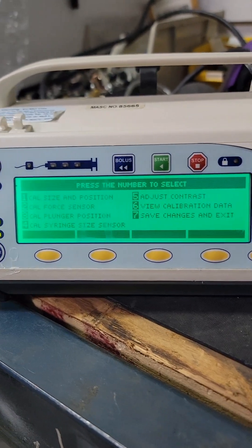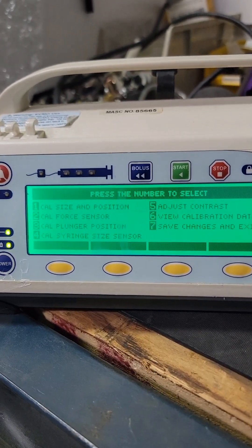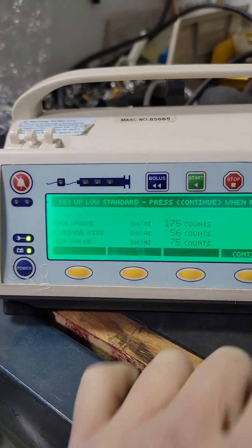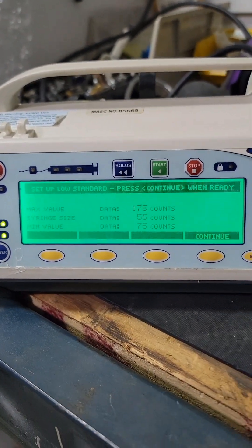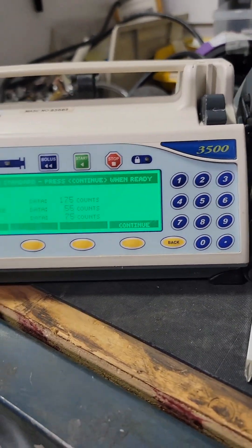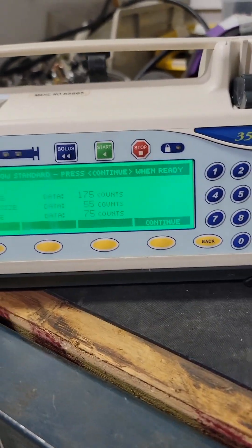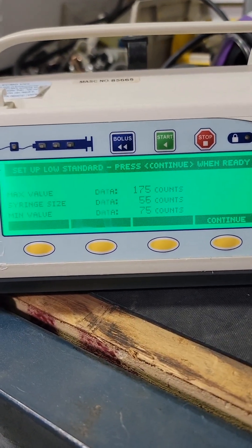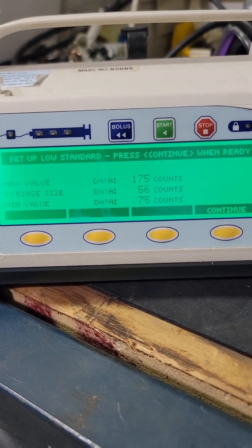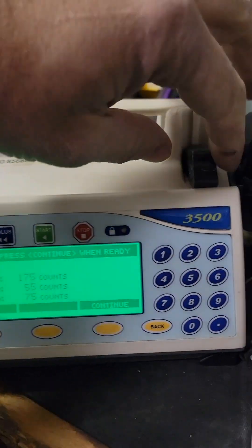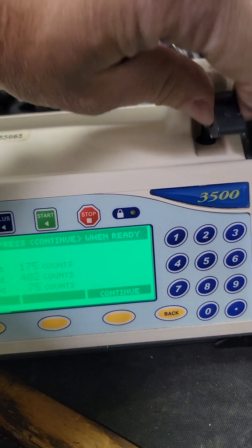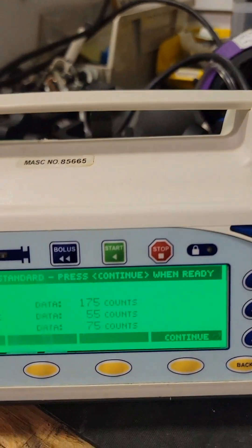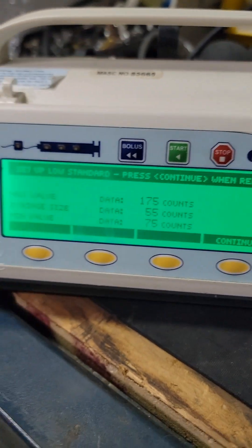We're gonna start with calibrate syringe size and position number one. What this does is calibrate both the syringe size sensor and the syringe position sensor.